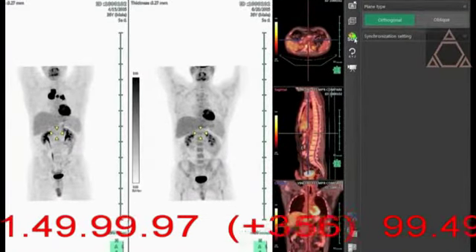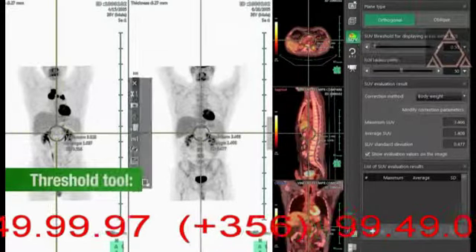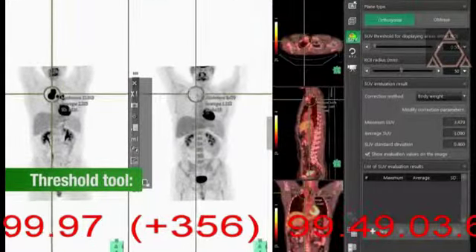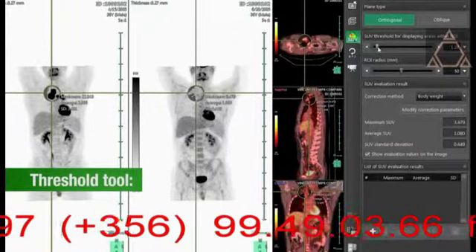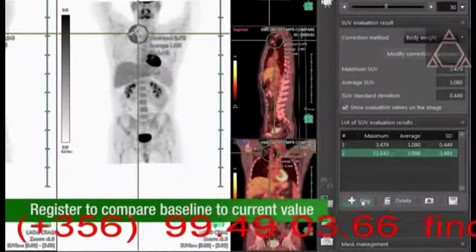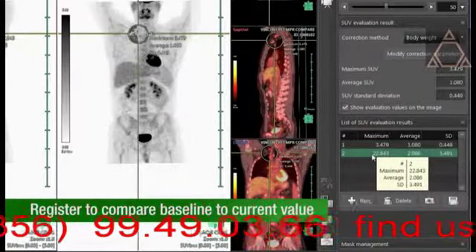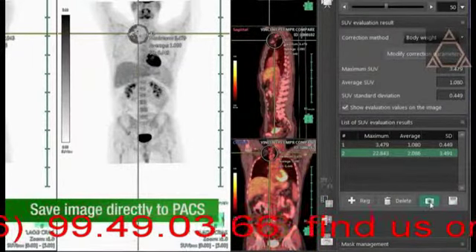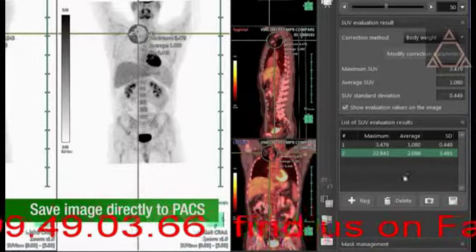To obtain SUV values, use the Threshold tool to zoom in on an area of interest. Register the new area and compare the baseline to the current value. Save an image of the comparison directly to PACS with one click.